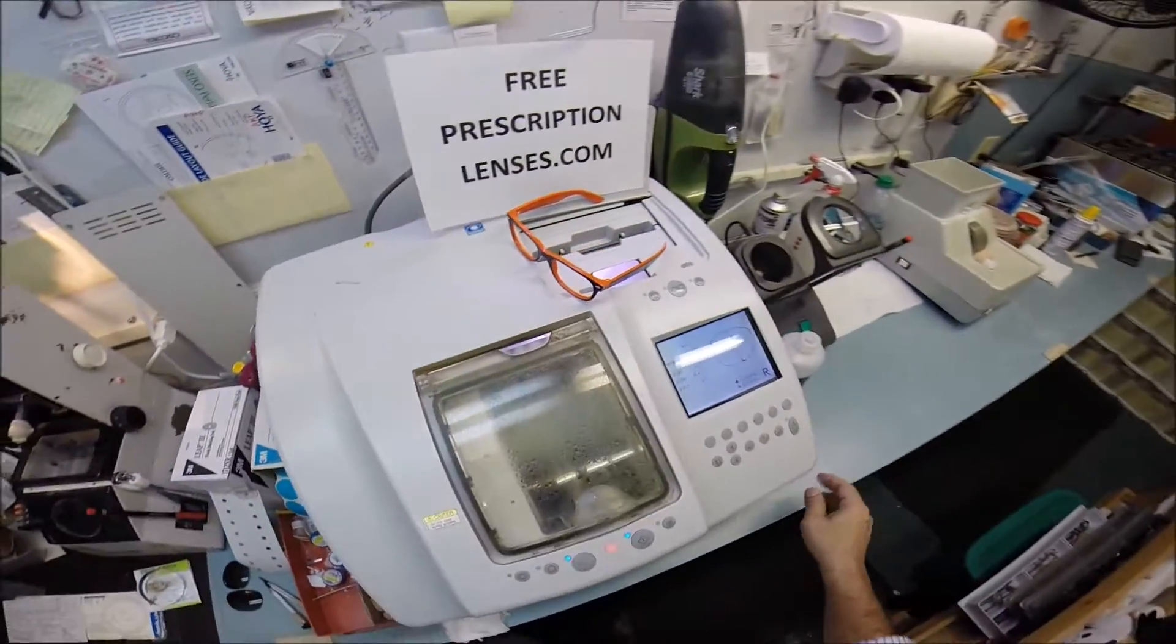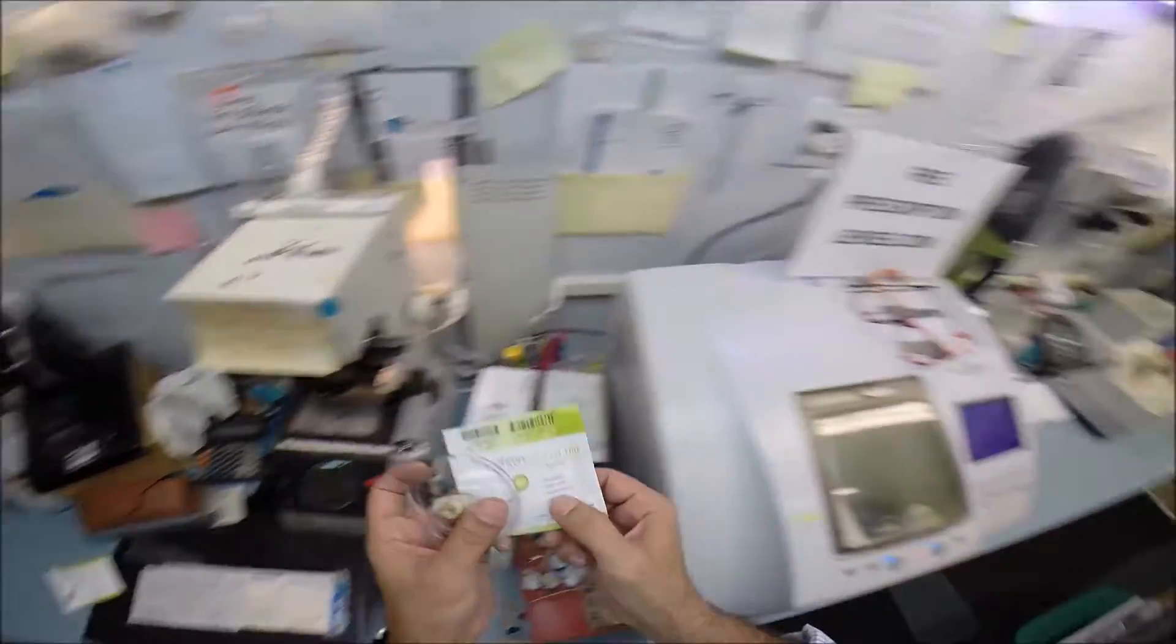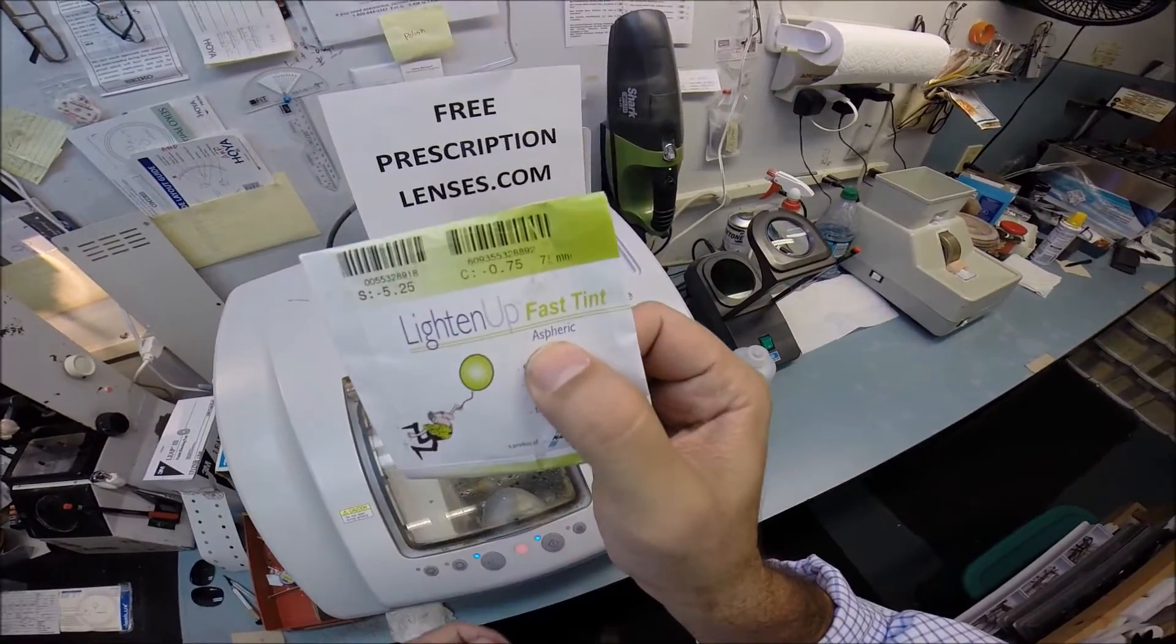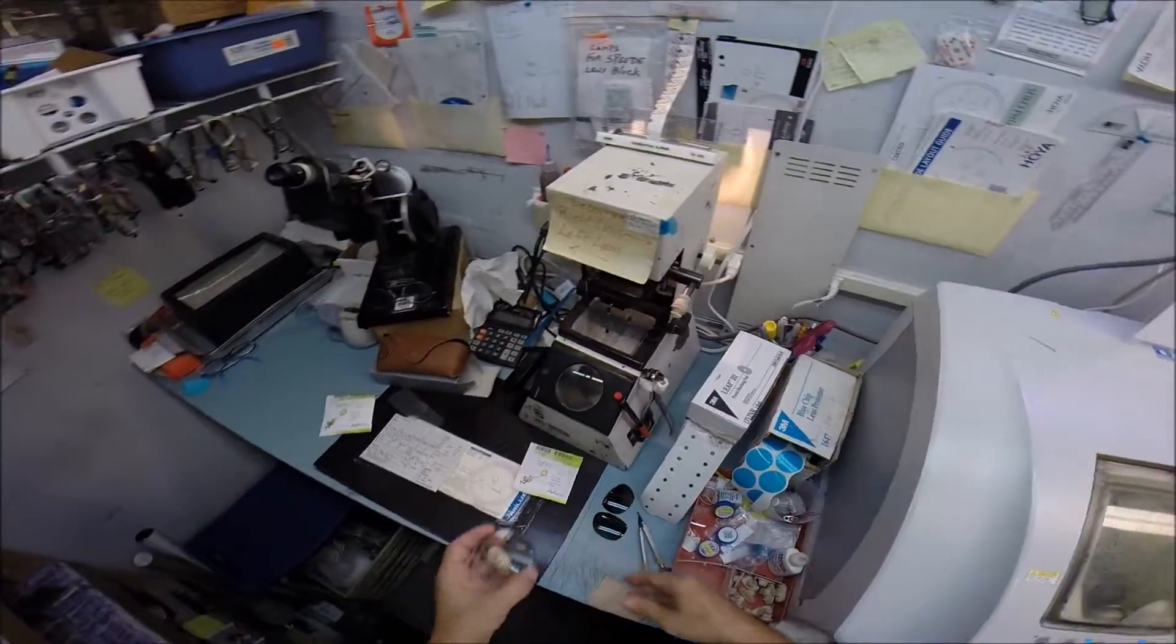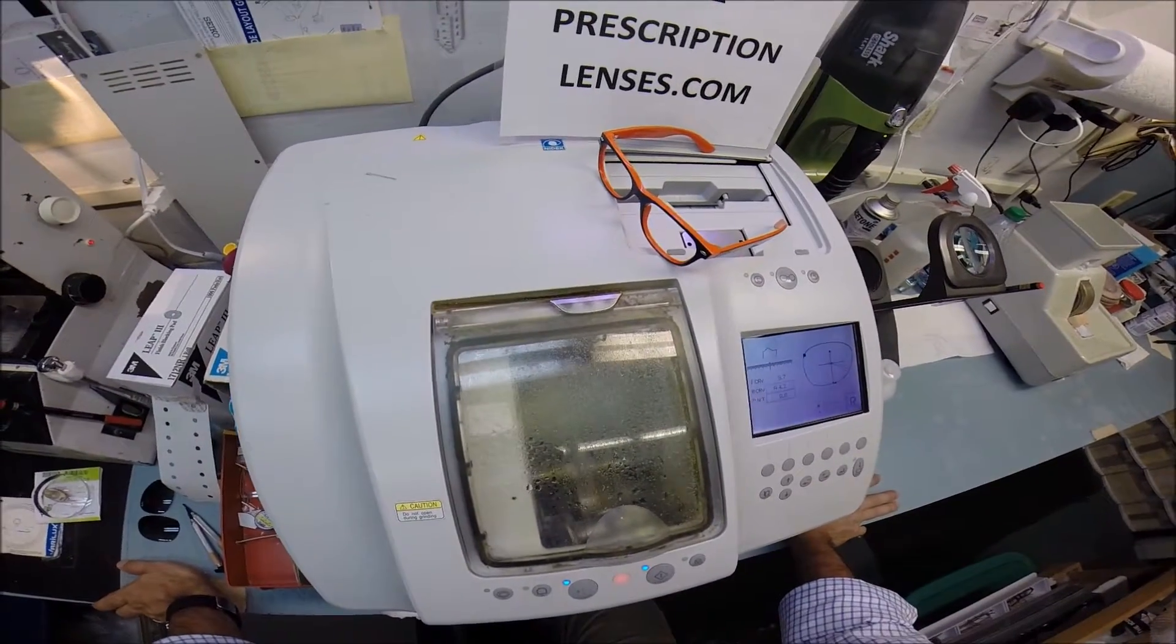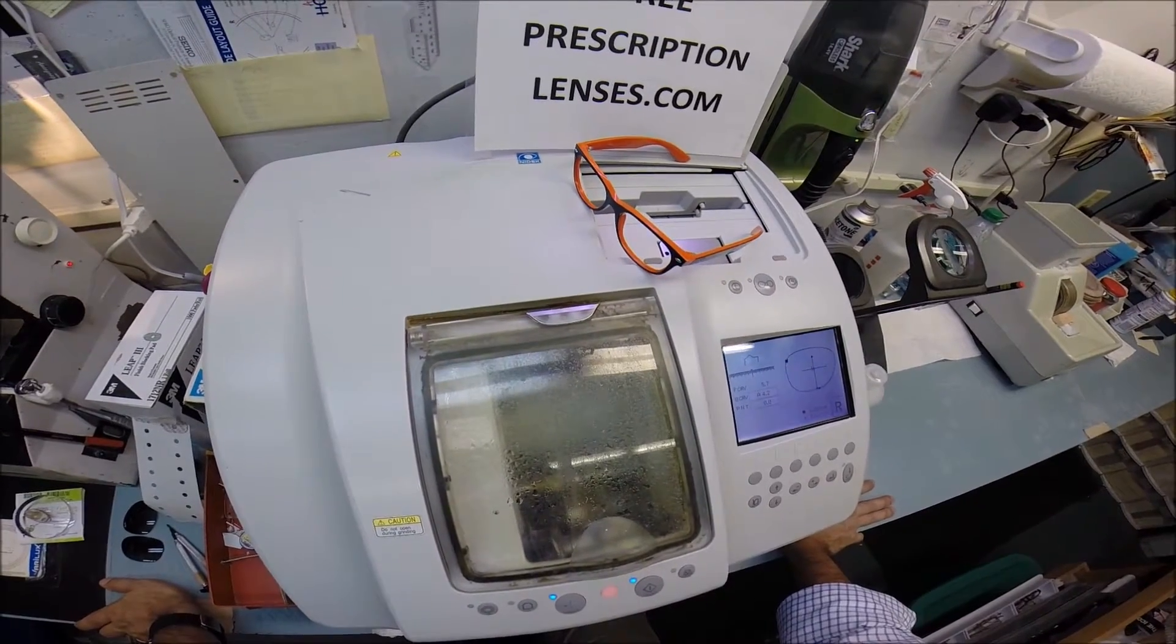Now, when you buy glasses from someone online, they charge you for plastic lenses. And if you want the thinner, lighter weight, unbreakable polycarbonate lenses, you have to pay an upgrade to that. And if you want the aspheric lenses, you have to pay another upgrade fee. So you have to pay for three lenses. Of course, from anyone else, you buy the frame for me and you will get a free, clear, single vision prescription lenses or non-prescription fashion lenses.